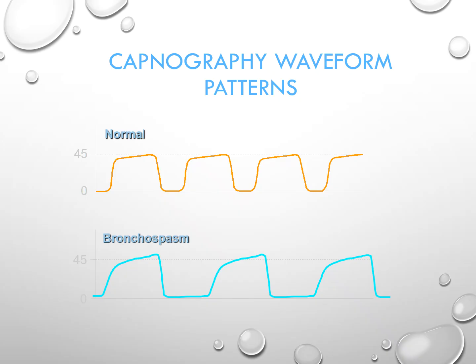And me being an educator, I would point it out to the team and just say, hey, listen, this is not an incidental finding. You never make a diagnosis based on this, but it's a classic finding that with someone in a severe asthmatic episode, you will often see this depiction, particularly if you have a closed circuit, meaning the patient's intubated and you don't have other issues going on, like a fast breathing pattern that's going to dilute that steady state, et cetera.